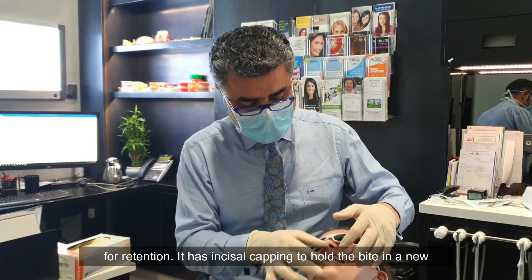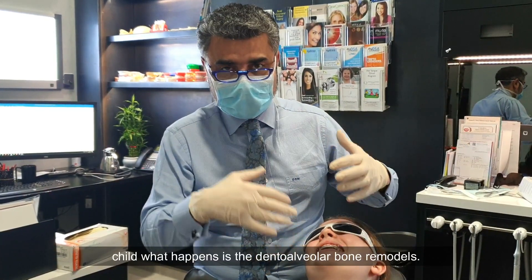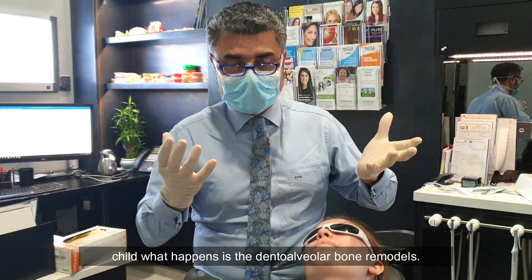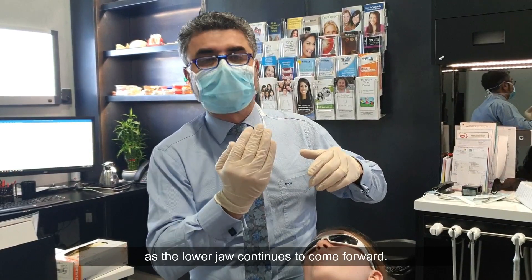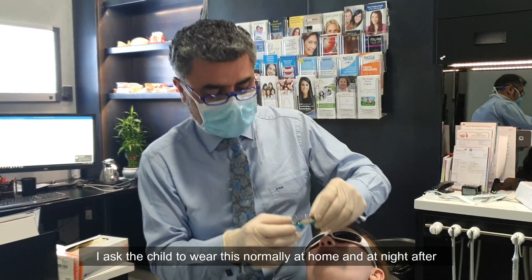The bionator to open has a labial bow for retention and incisal capping to hold the bite in a new position. We allow the molars to erupt, and in the growing child the dento-alveolar bone remodels, so you're actually getting improvement of the lower face height as the lower jaw continues to come forward.